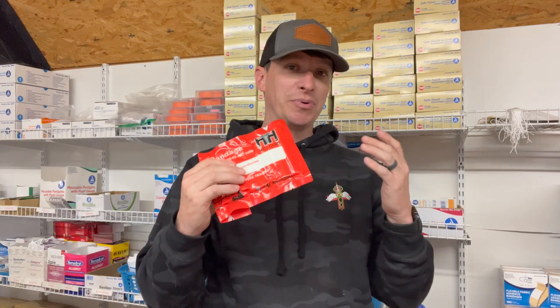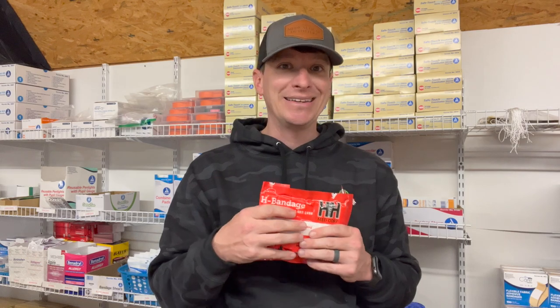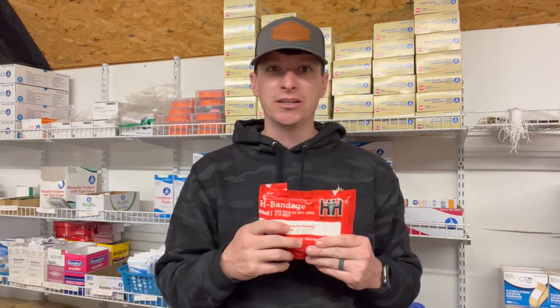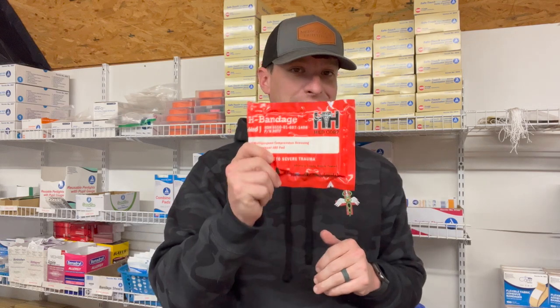I like this bandage because it is super small. Probably wouldn't put this in a trauma kit, but I'm going to think about this in like a briefcase, laptop bag, EDC, something like that, just because it's so thin. It's lightweight, it's thin. I can do a ton of things with a pressure bandage. So if you're looking for something to throw in your man purse or something like that, I think this is it.